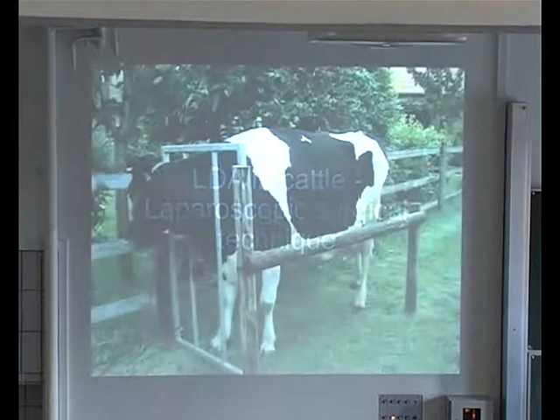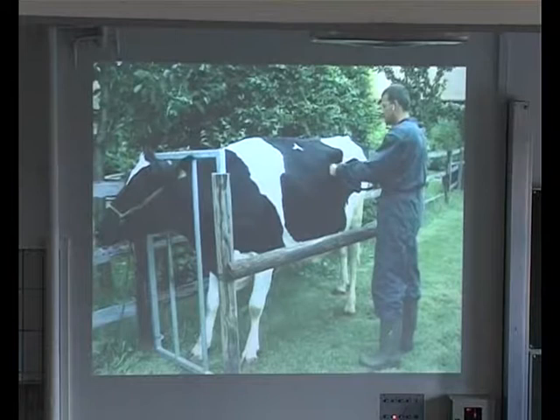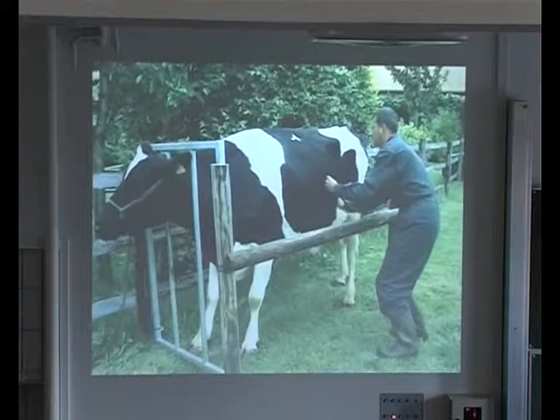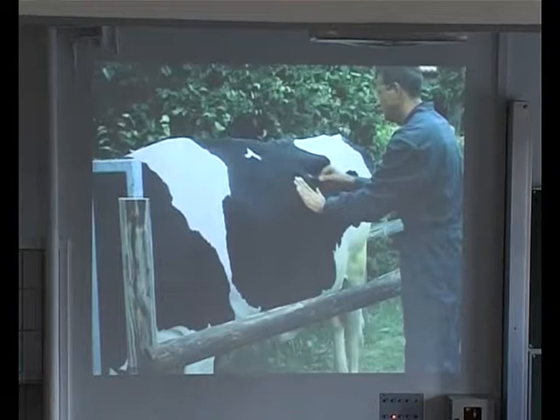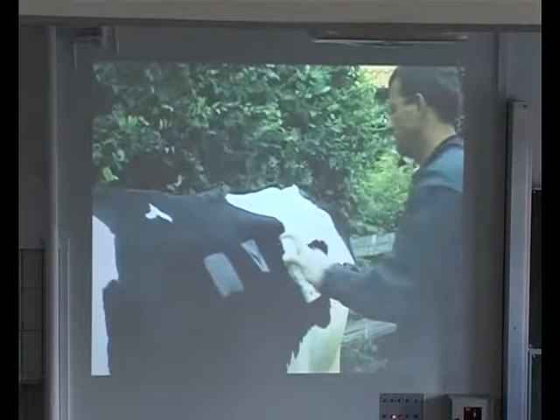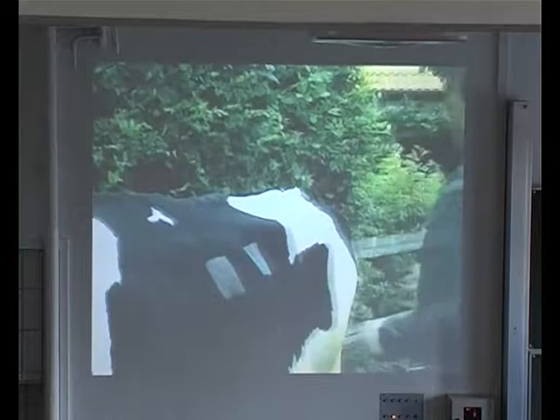In the beginning of every surgery, we have to improve our method because sometimes we have a dislocation of the abomasum in the morning, and in the afternoon when we do the surgery the abomasum is not displaced. So in the beginning, please control your diagnosis. Now, we need 2 positions in the abdomen to fix the abomasum, and the first is always to create a pneumoperitoneum.